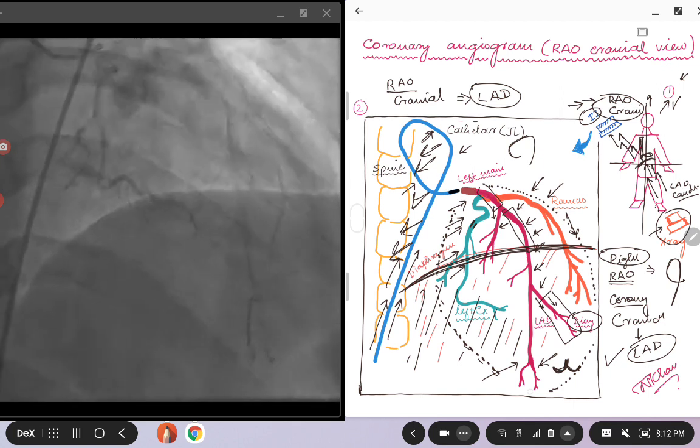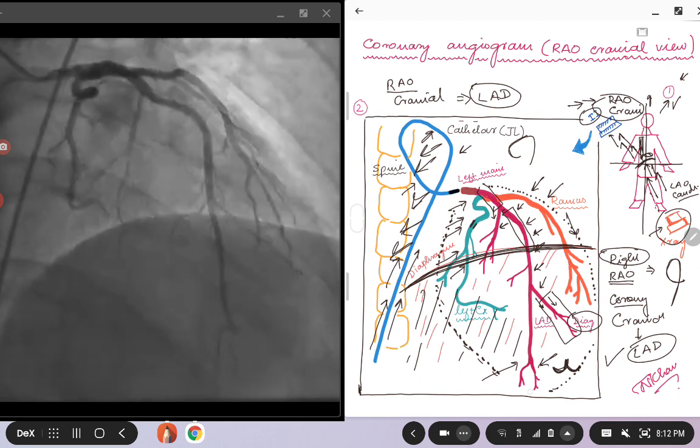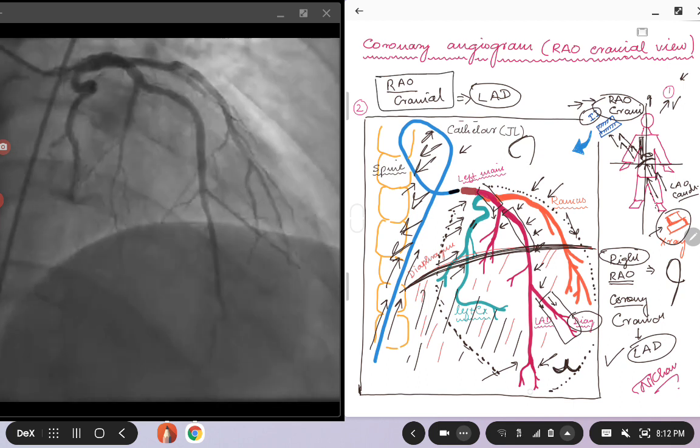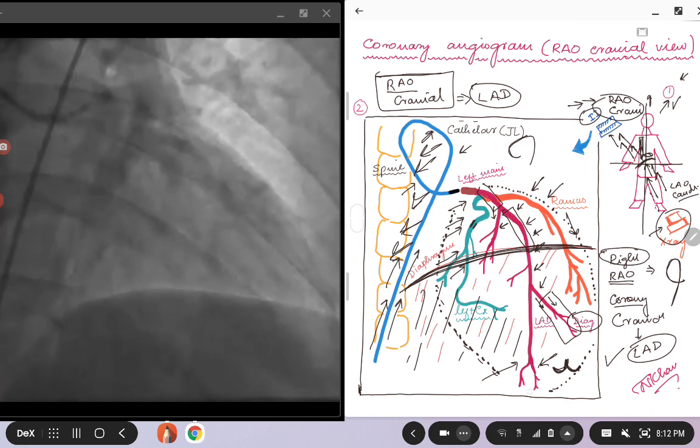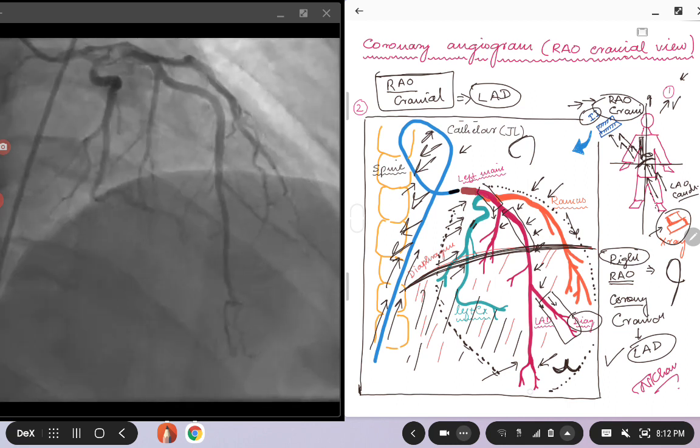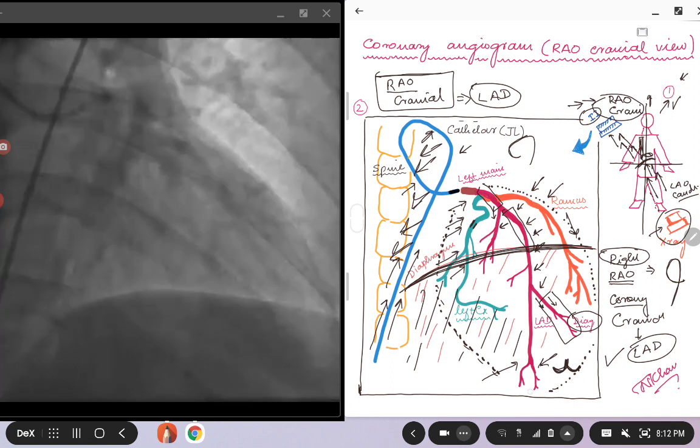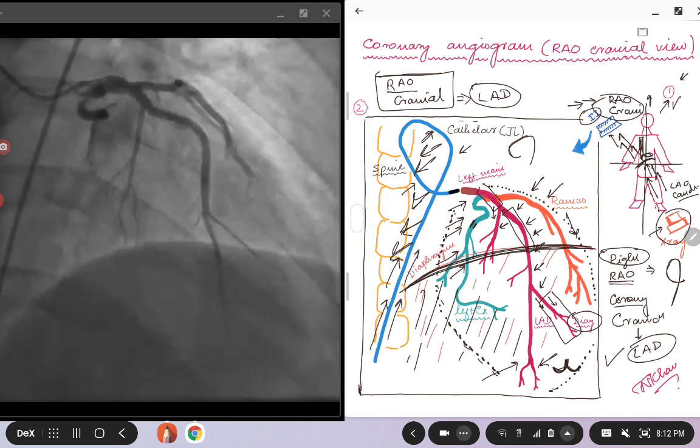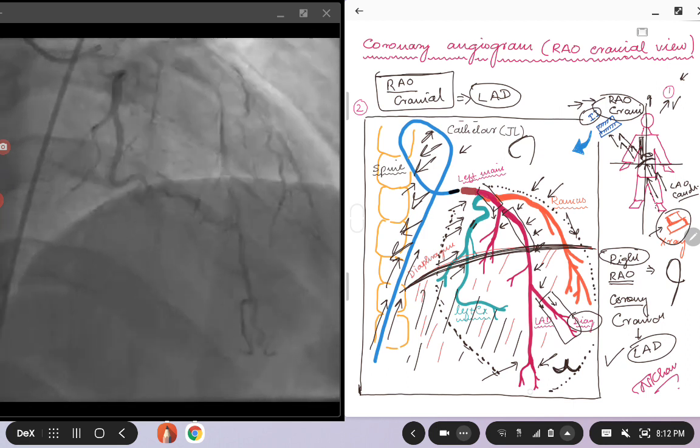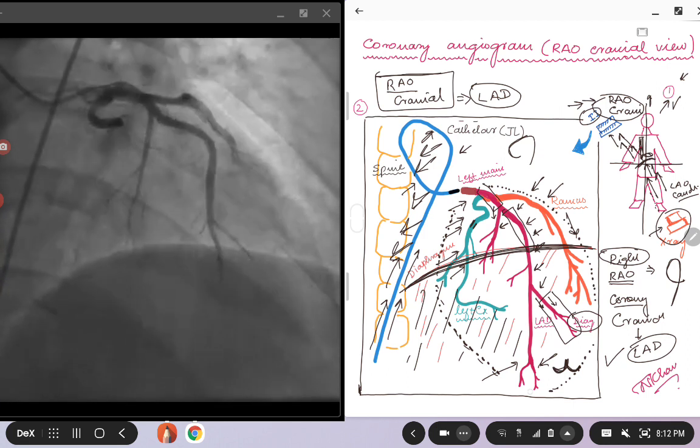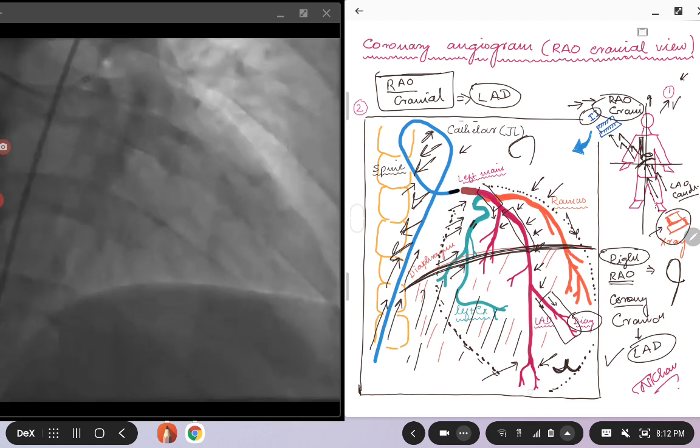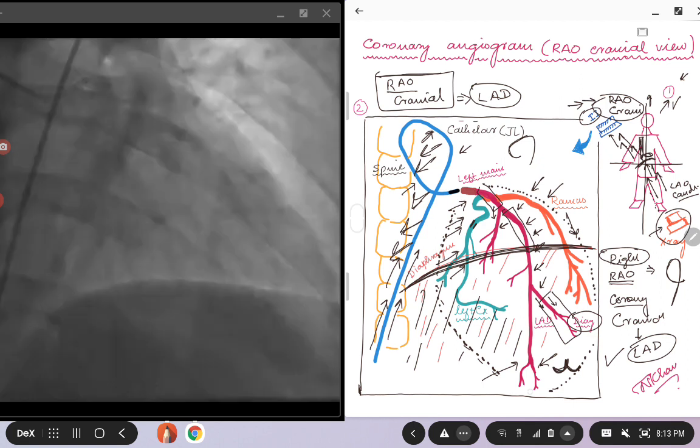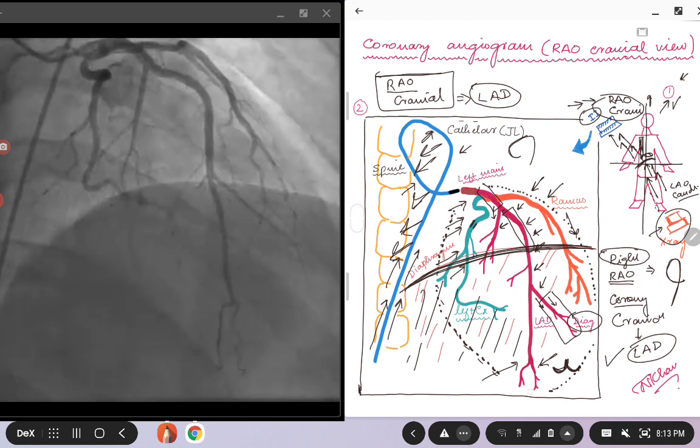This was a very quick overview, trying to put things together for the RAO cranial view. We will try to keep it very simple as we have already discussed all these things in the other views. Basically what we will be doing in these series is reinforcing the idea as to how we recognize the arteries and other mediastinal structures, trying to recognize the image. I hope this was helpful. Have a very good day.